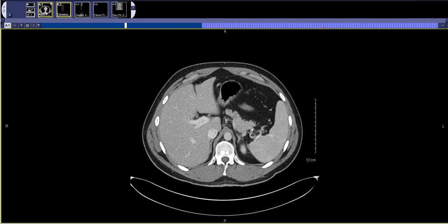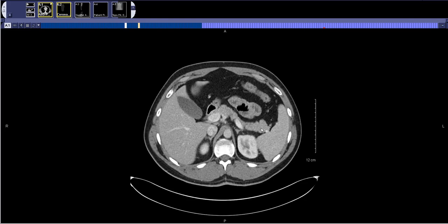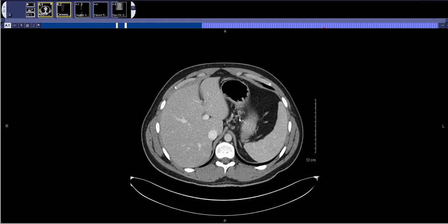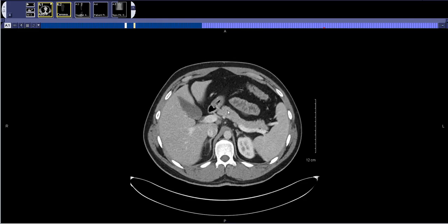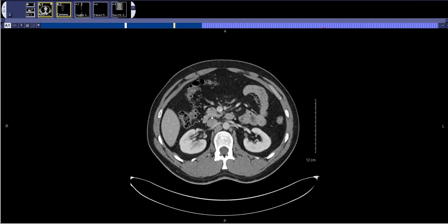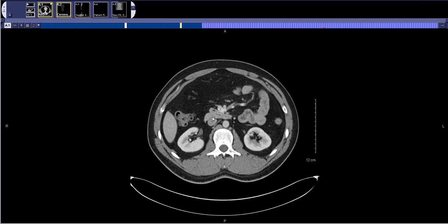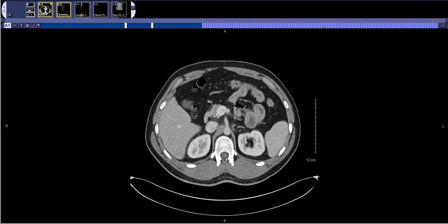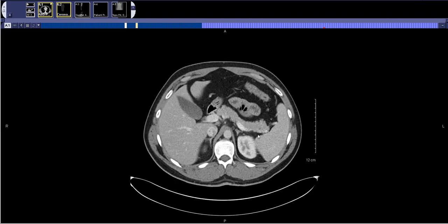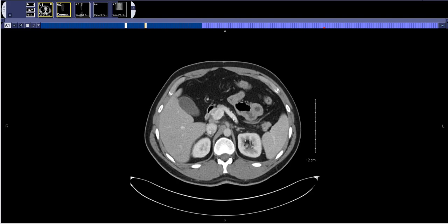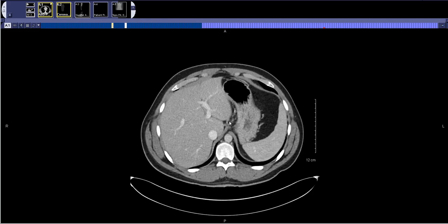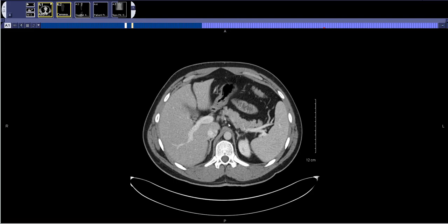After I've looked at the spleen, I move on to the pancreas. While I'm looking at the pancreas I'm looking for any masses, I'm looking for the pancreatic duct, and then I'm usually also looking at the splenic vessels and portal vein to make sure they're patent.